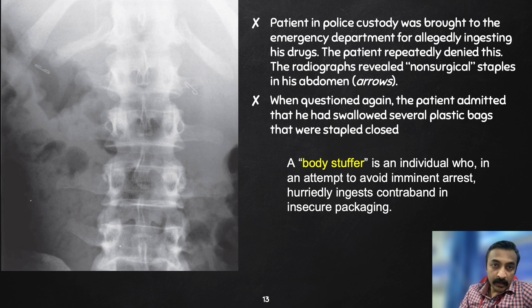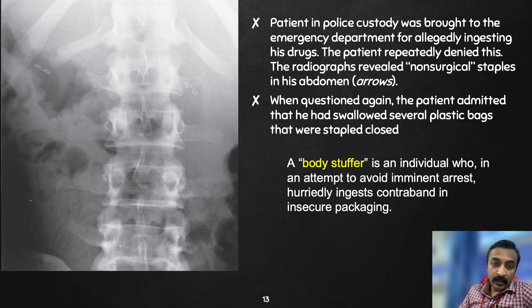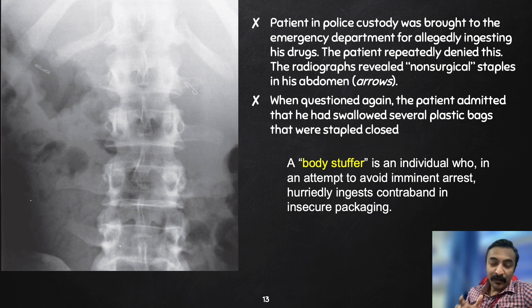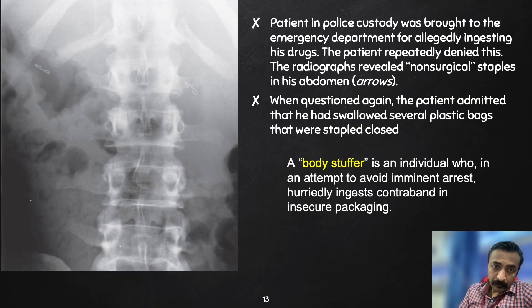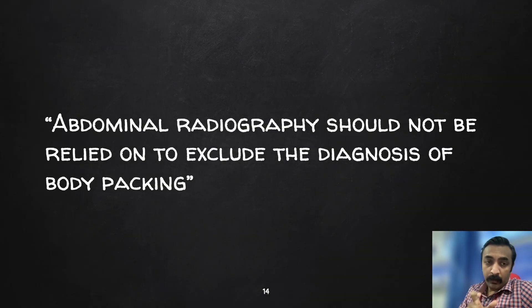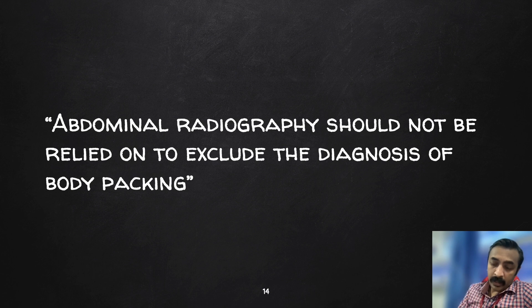This next case is slightly different — what you see here looks more like staples. This is something called a body stuffer — an individual who, in an attempt to avoid imminent arrest, hurriedly ingests contraband in insecure packages. The difference is that a body packer's packets are designed to remain in the abdomen until the destination, whereas a body stuffer hastily swallows the drug when confronted. The key message is that abdominal radiograph should not be relied on exclusively to exclude body packing — CT would remain the more definitive diagnostic tool.